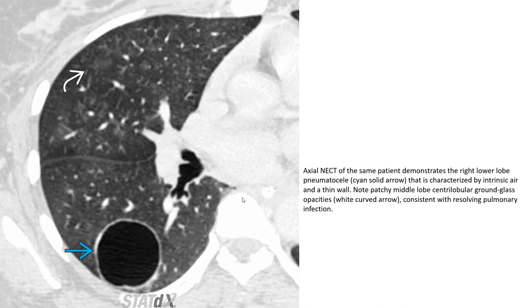On non-enhanced CT, the right lower lobe pneumatocele is characterized by a thin-walled air-filled structure. Patchy middle lobe ground-glass opacity is consistent with resolving pulmonary infection.